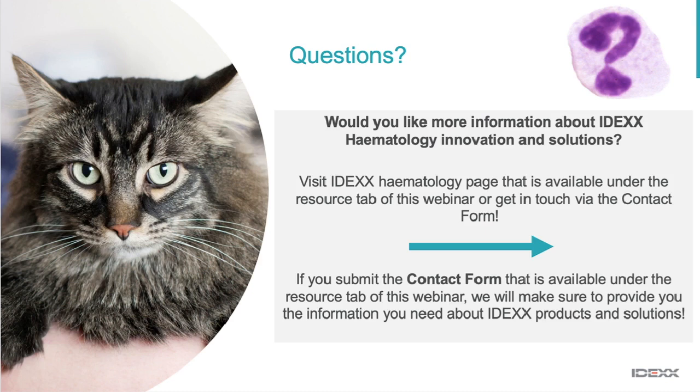I think first we as veterinarians need to really grab the power of what that reticulocyte count is telling us, and the analyzers have really progressed quite nicely in their ability to identify at least those aggregate reticulocytes.